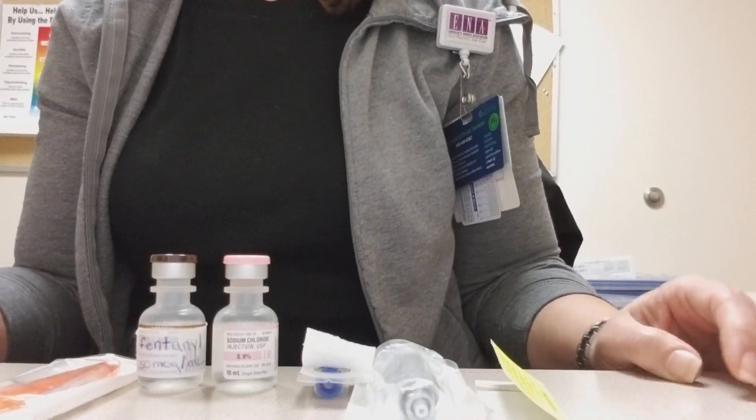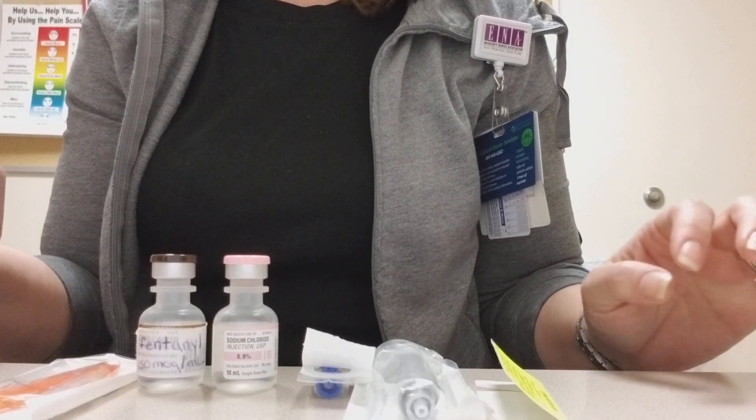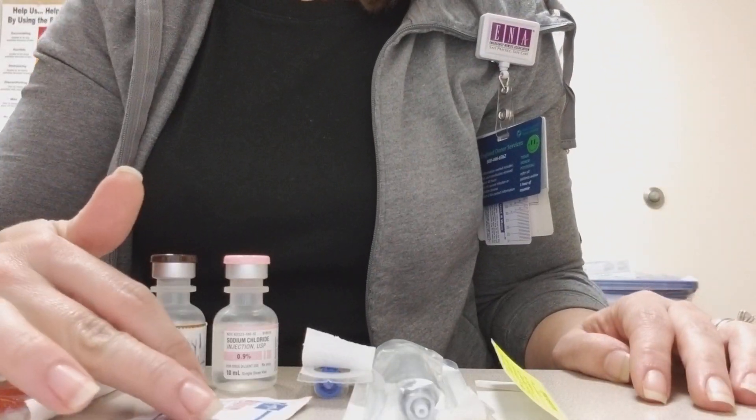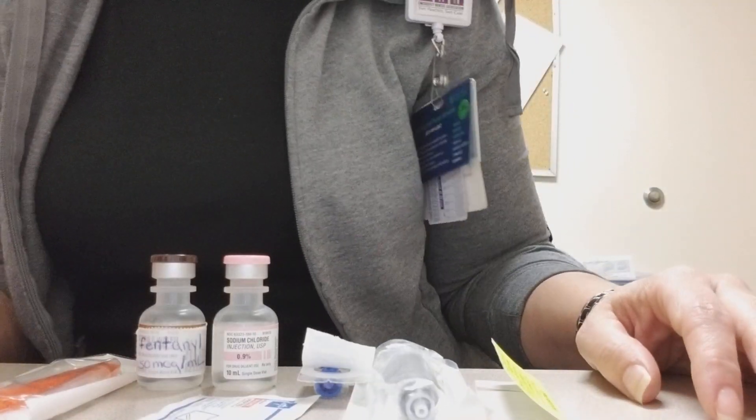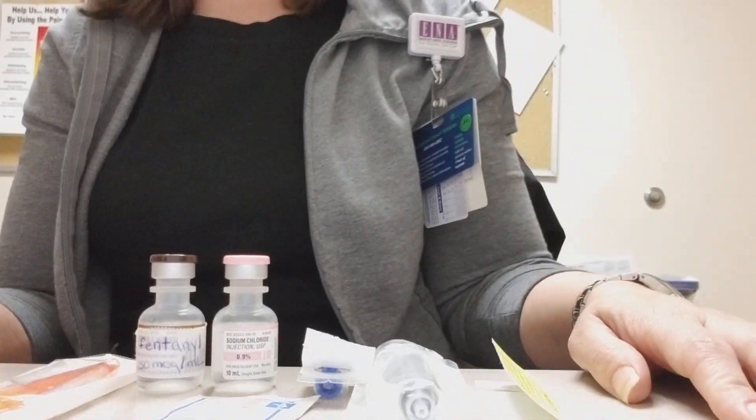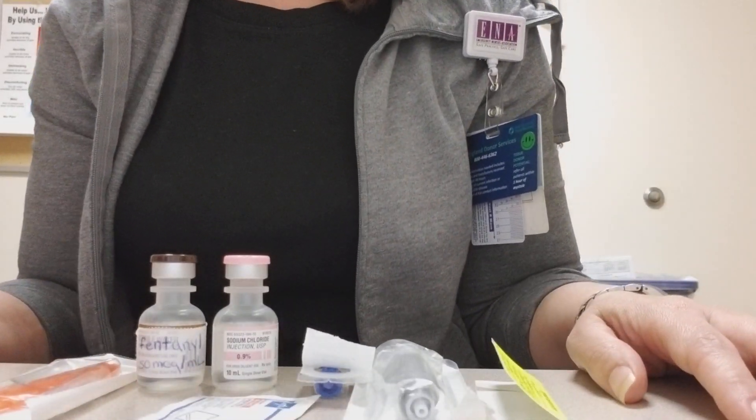Hi guys! I am here to show you super quick the really easy, safest way to draw up your IV push medications if a diluent is needed, instead of using the pre-mixed flush syringes.